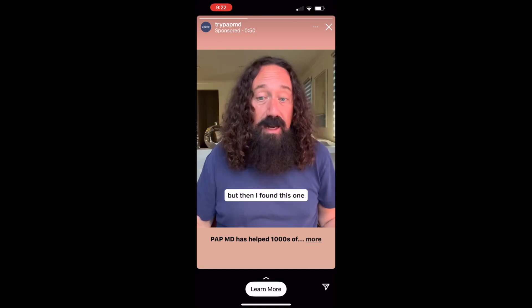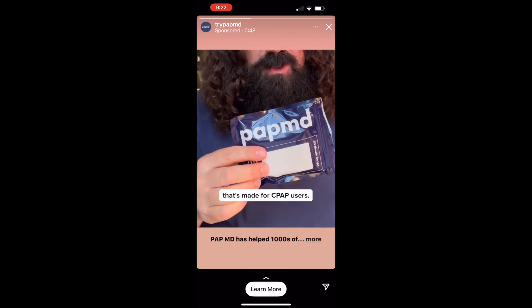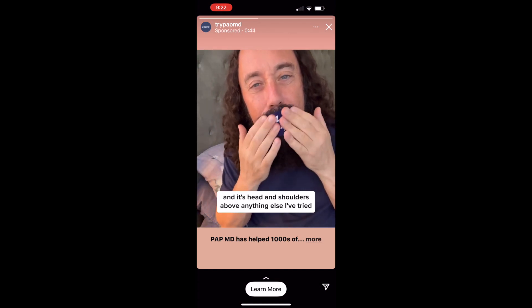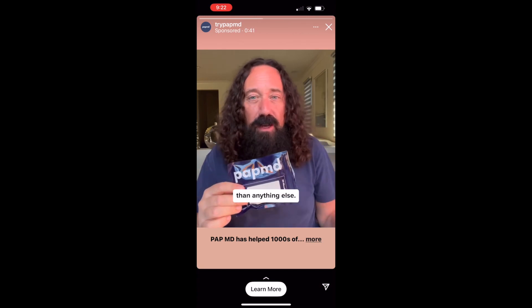I almost gave up on mouth tape, but then I found this one that's made for CPAP users. It's called PAPMD and it's head and shoulders above anything else I've tried. There are a few reasons why I think it's better than anything else.